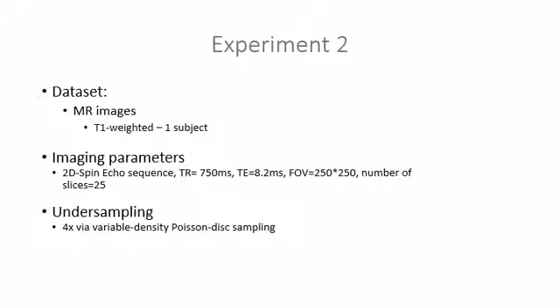First time I tried to obtain T2 weighted images, but apparently the sequence was only designed for a specific plane, and I used a different plane for imaging. So what I obtained, the slices were like projected onto each other. Then I tried to obtain T1 weighted images via an MPRAGE sequence. This time the TR values were not appropriate. Therefore there was a small contrast between white matter and gray matter tissues.